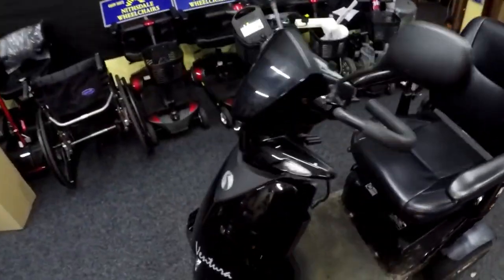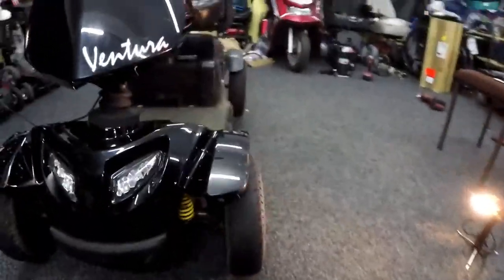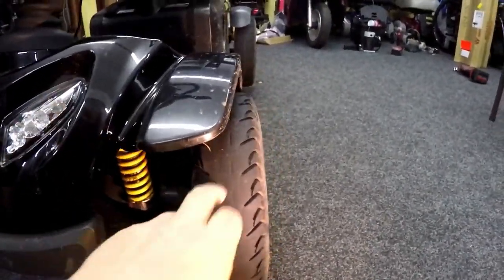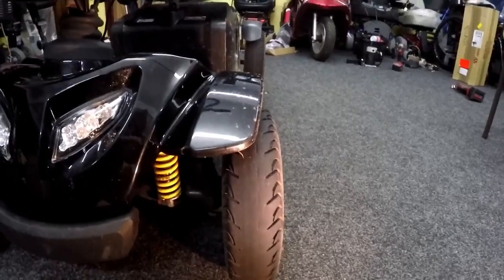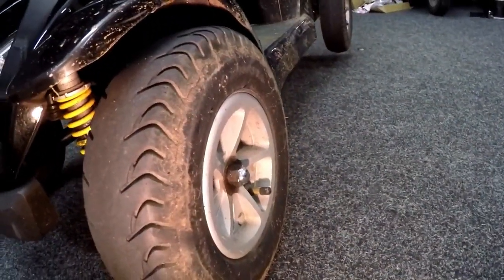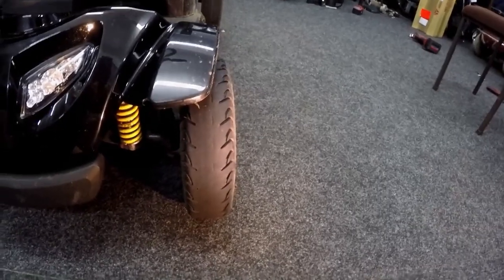Also, when I was out, I did notice something else wrong, which is kind of wear and tear. It's not the end of the world. It needs new tyres. As you can see, the tyres are bald as a coot, and it's only the front ones. These are Pacific, size 410 by 350 by 6, and with that particular tread pattern you can only get these from the supplier.